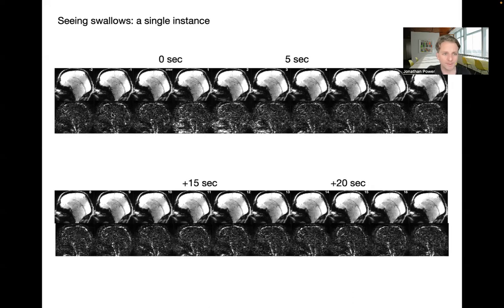So what I mean is this image is this minus that. This image is this minus that. Okay, and this is also the absolute value of these scans, or those differences. So now scanning across all 20 volumes, it's obvious that the brain is pretty much unchanged, except for these three volumes right here, where there's a lot of signal change, and especially in the mouth.